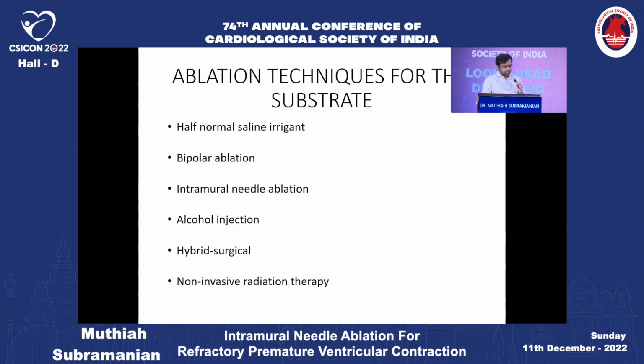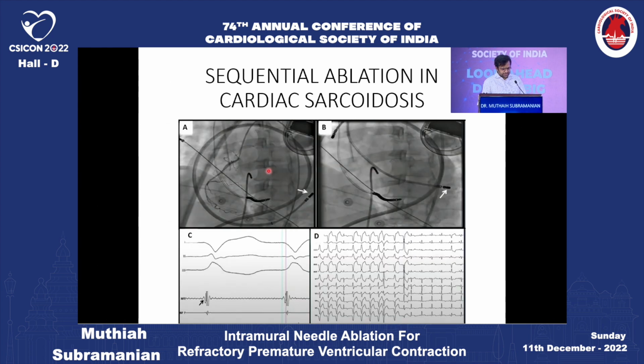So a few of the different techniques that have been described, and I'll discuss a few slides on each of these, is to change the fluid medium, changing it from a normal to a half normal saline. Try a bipolar ablation and intramural needle ablation, use of alcohol, surgical approaches, and non-invasive radiation therapy. So we'll just go through a few of these with some case examples.